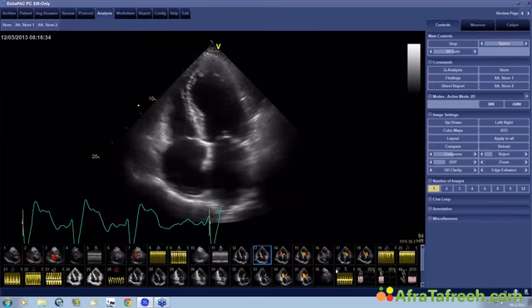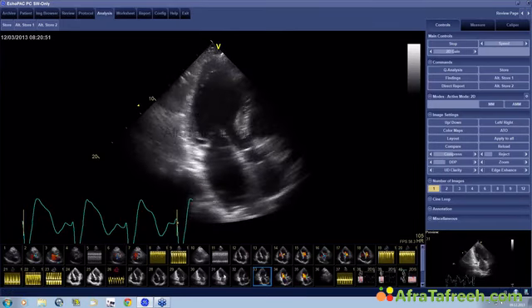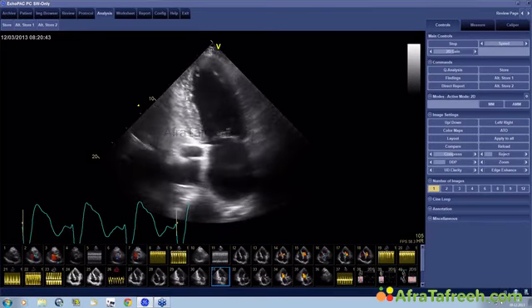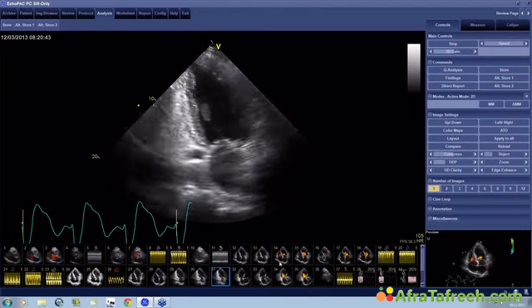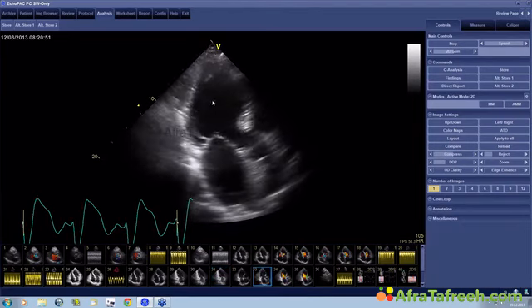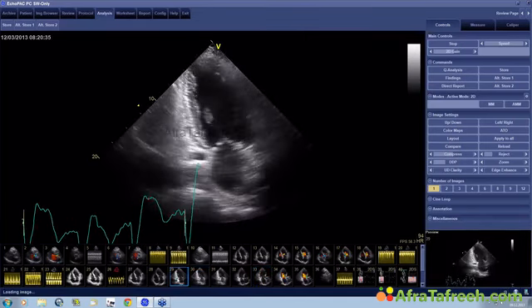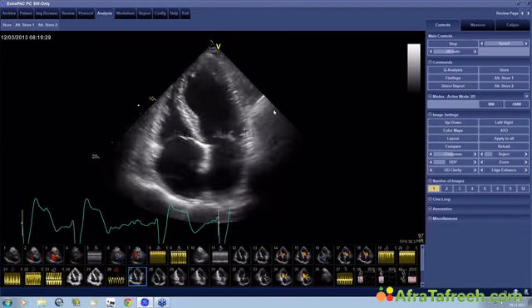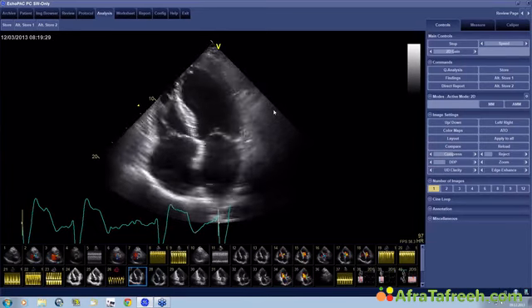In other words, patients who have coronary artery disease have less probability of recovering versus patients who have dilated cardiomyopathy. And if we look at the myocardium here, you can see that it's fairly thick. It looks a bit worse here inferior from a contractile point of view. And the ventricle is dilated, but it's not huge. So there is a low scar burden here. There's a relatively small ventricle here. We have fairly thick myocardium. So everything speaks in favor of this being someone who would significantly benefit from the procedure.